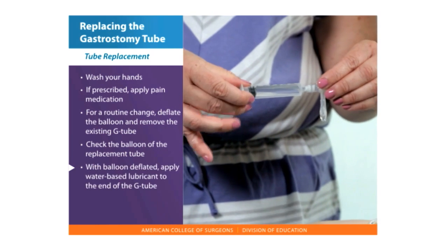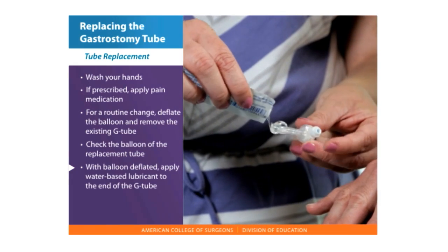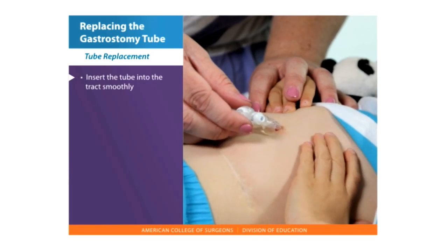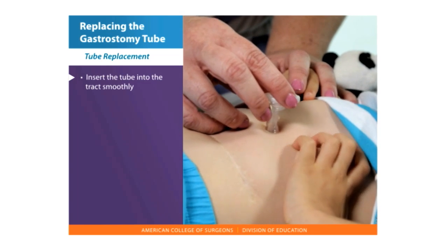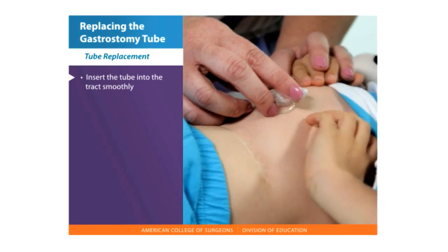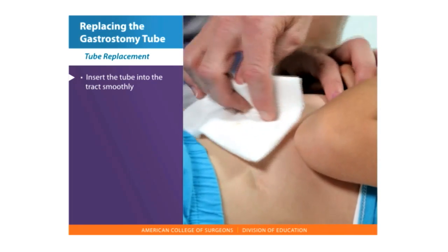With the balloon deflated, apply water-based lubricant to the end of the gastrostomy tube. Insert the tube into the tract smoothly. It should be a snug fit, but if it does not pass smoothly, it may be at the wrong angle and lead to the wrong cavity.